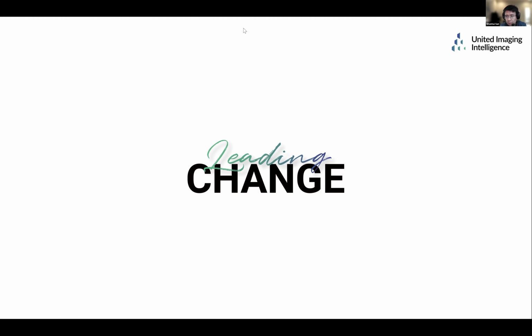We certainly utilized deep learning to solve the denoising problem and also the reconstruction problem. My understanding is, not just for UIH but for Siemens, GE, Philips, there are many deep learning algorithms already deployed in the scanner to serve this purpose, to make the image quality much better and the scanner much more efficient.